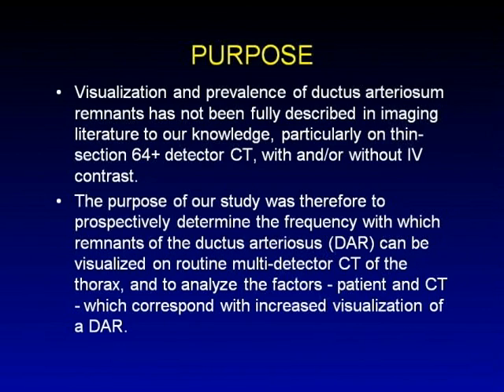Therefore, the purpose of our study was to evaluate the frequency of visualization of the ductal remnant on routine thoracic CT, as well as to analyze the different factors, both related to CT technique and the patient, which correspond to a higher rate of visualization of the ductus remnant.